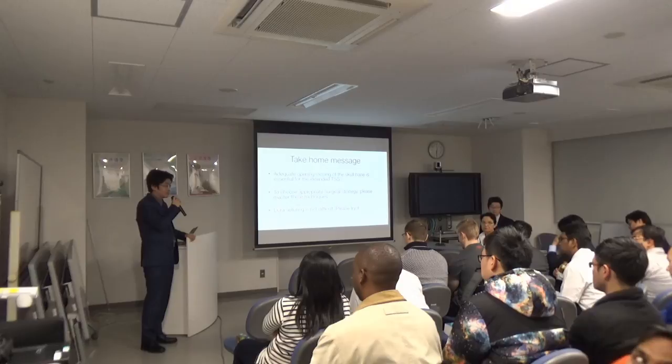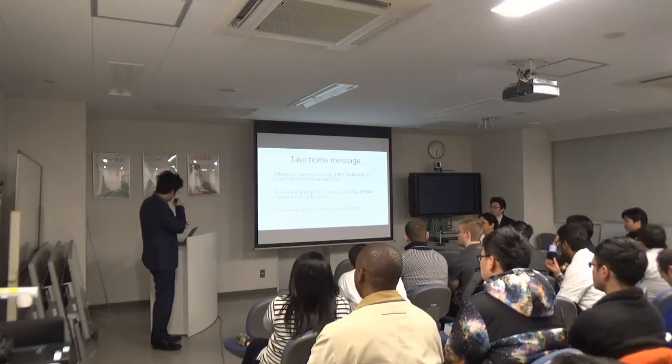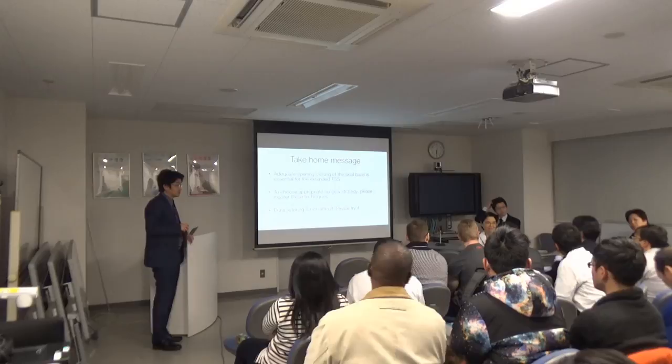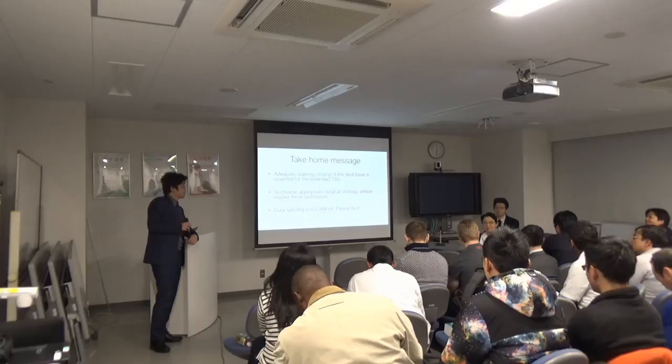Takeuchi, for suturing dura, what kind of needle holder is your preferred or best one? I use a thin shape needle holder. It's invented by Fujita Ika. How about Professor Watanabe? I use a Mizuho needle holder, also a thin tip. Is that your original one? No, that's not my original. What size? 6-0 Prolene.